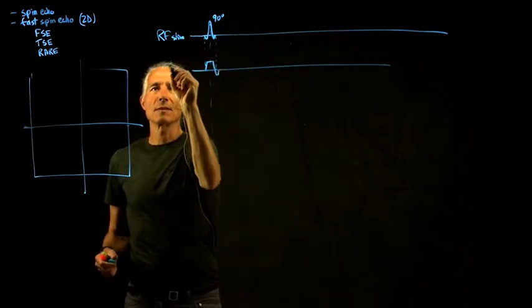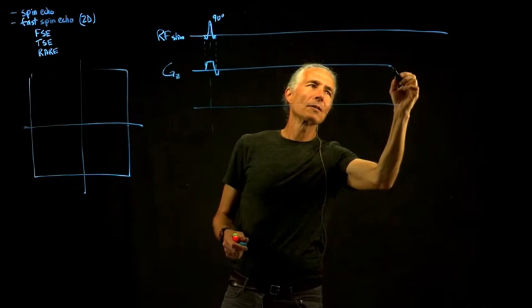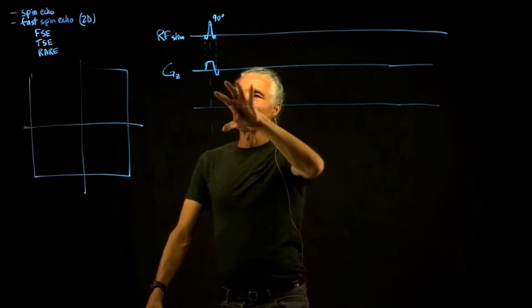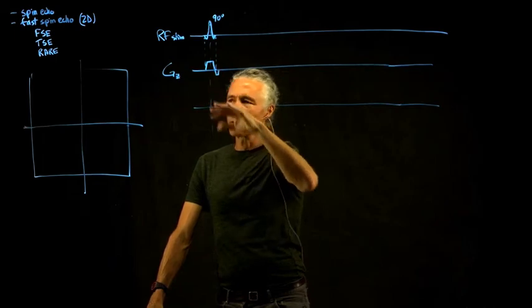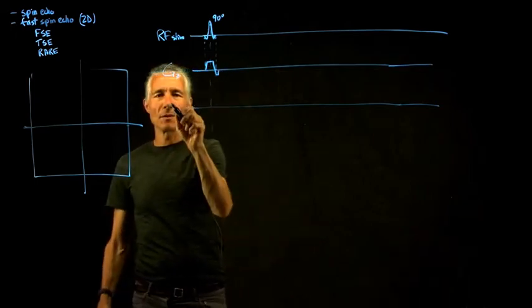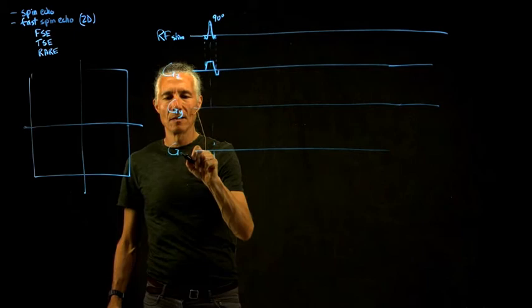So we're selecting a slice in the Z direction, and all these things would be written out differently if we're doing a different axis, but usually there's kind of the default. You sort of by default consider Z to be the slice direction, and then just say everything would be different, but we'll just always put the slice selection on Z and the phase encode on Y and the readout on X.